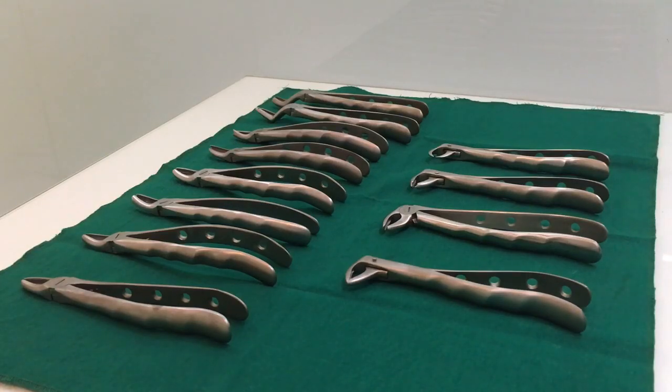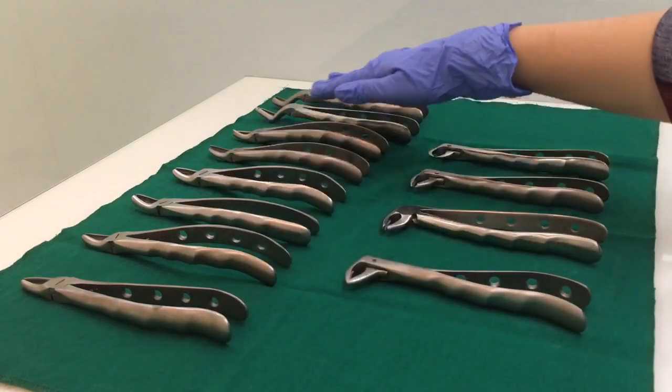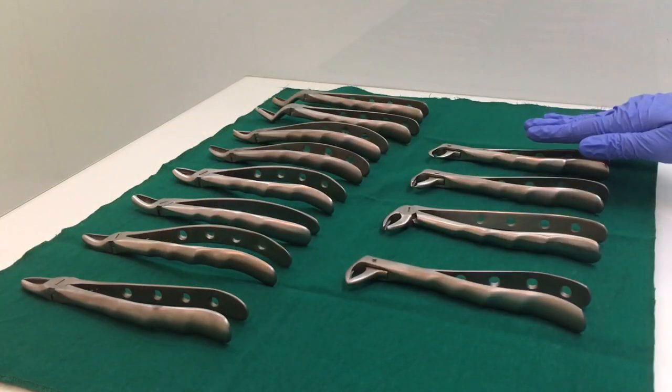Many find it very confusing as they more or less look similar, especially the upper forceps. There are two sets of dental extraction forceps: the upper forceps and the lower forceps.